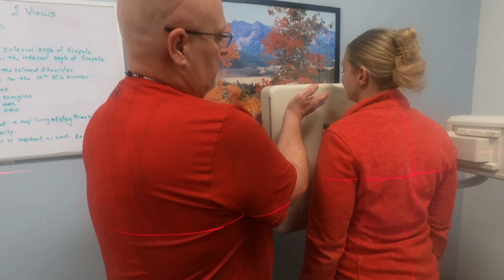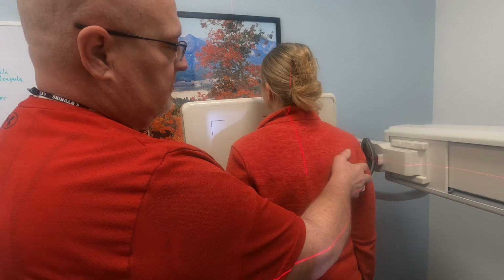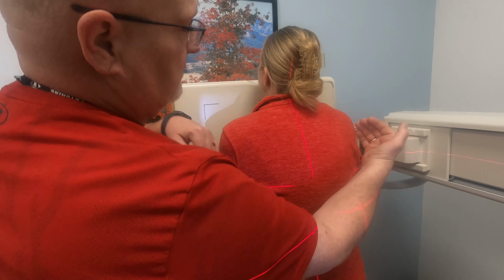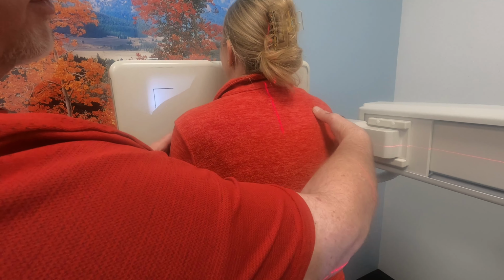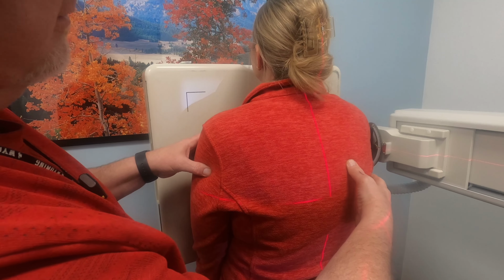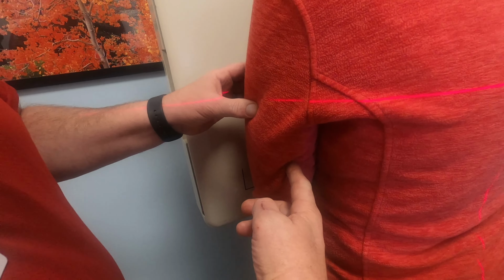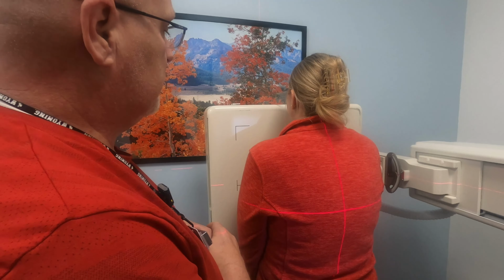But anyway, we've got 1.5 inches up here. We're going to have the patient roll their shoulders forward, okay? We want to move those scapulas out of the way so we can see lung tissue instead of scapula, right? So a central ray goes right down her back right here, okay? And we can go over here, we can see light on the lateral, and we've also got light on this lateral, so we know we're going to get everything we need to get.